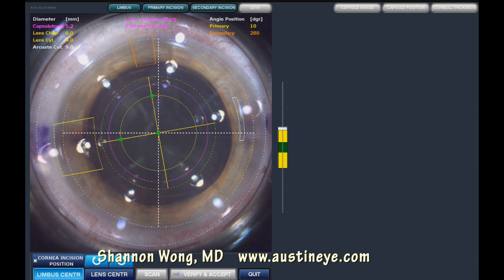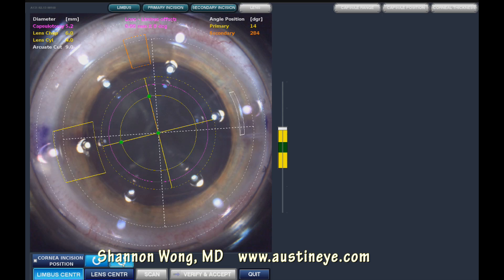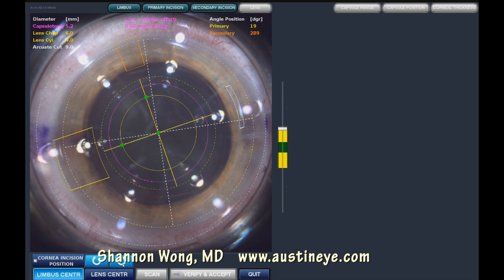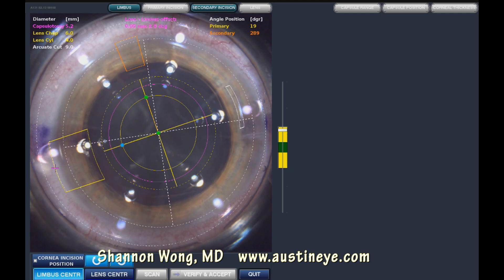The diameter of the capsulotomy I've programmed for this case is 5.2 millimeters. I have pre-marked this patient where you can see the purple marks at the 3 and 9 o'clock position. We need to pay close attention to avoid intersecting any of the radial keratotomy incisions. Here we adjust our primary incision location and our arcuate incision location, which is located at about 230 on the position of the cornea, being careful to avoid any of the eight RK incisions.